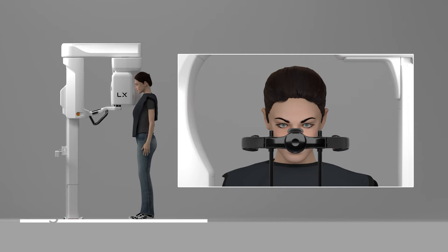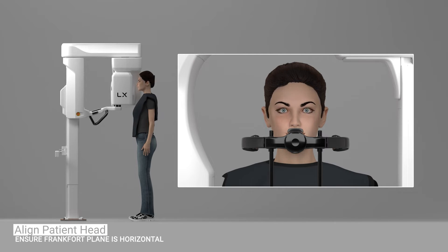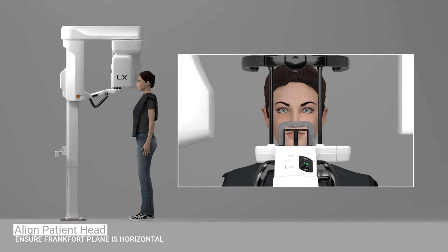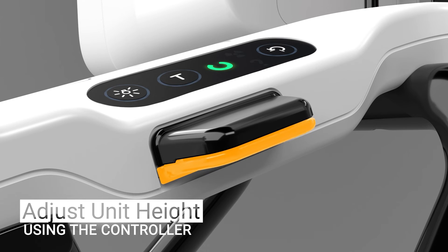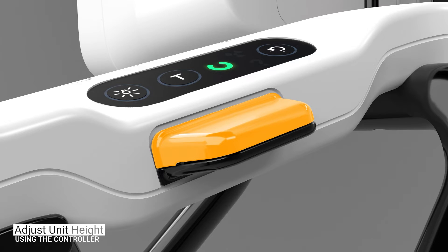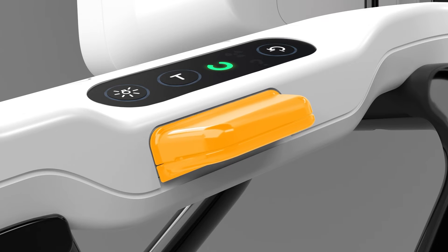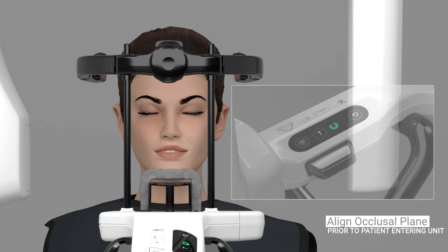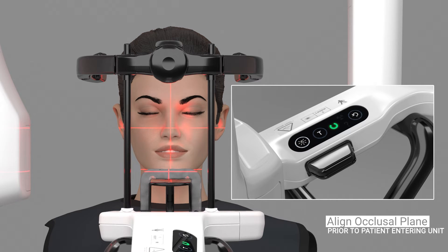Adjust the patient's Frankfurt plane, which should be positioned parallel to the floor. Raise or lower the unit as needed so the patient's chin is level with the chin rest. To slowly raise or lower the unit height, press up from the underside of the controller or down from the top. For faster movement, pinch both sides of the controller while pressing up or down. Prior to the patient entering the unit, tell the patient to close their eyes. Turn the patient positioning lights on by pressing the positioning light button on the control panel.